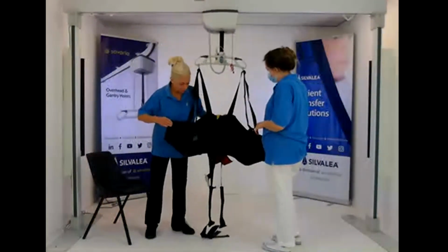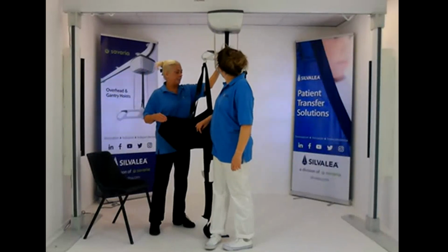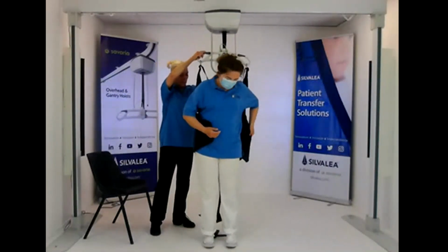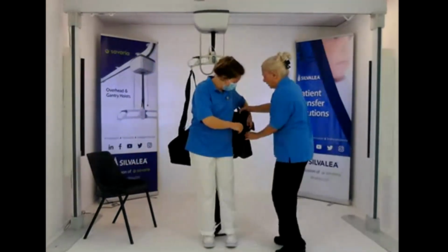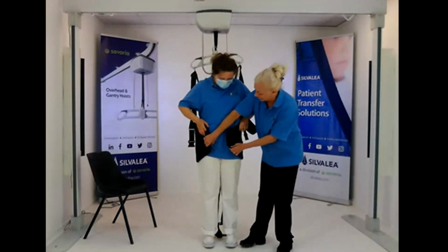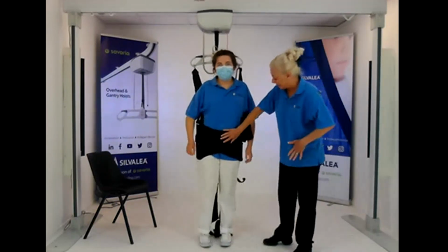So we've got this trunk section that will stretch around, and then we just put that one. Just take this up higher. Okay, that's too high. So Laura stretches it around. It's got to fit the waist. Bring it around. It's got lots of Velcro on, which catches significantly, and there will be pads and patches that will protect it. That's the first thing, to stabilize the hip area.